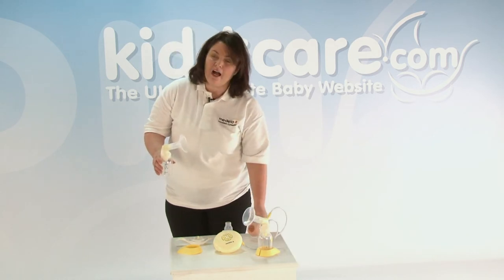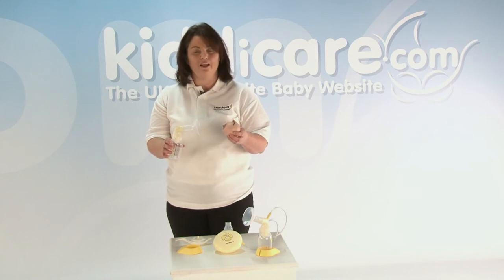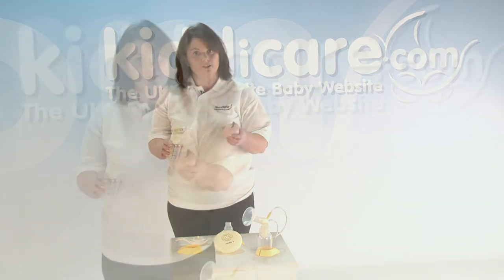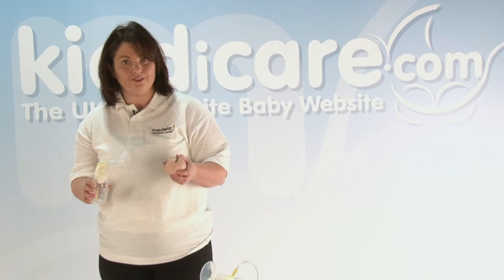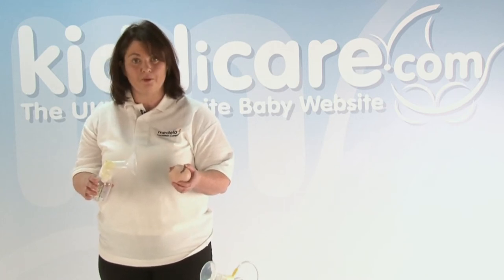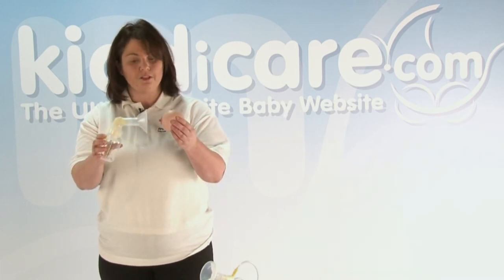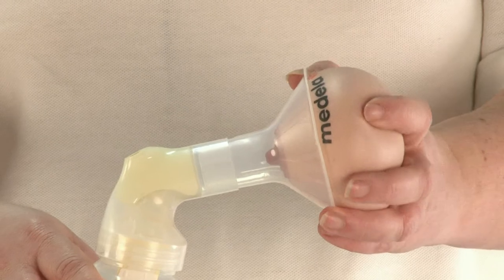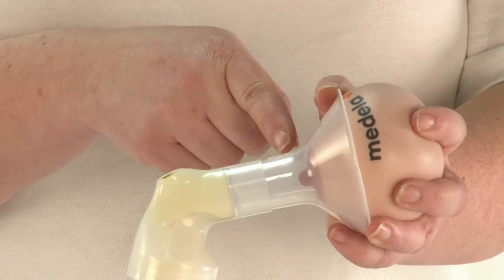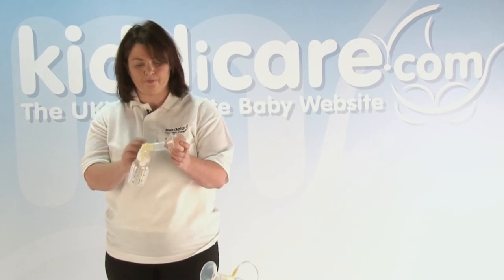When we're talking about how the pump works, it's very different to breastfeeding, how we put the pump onto the breast. When you put the baby onto the breast, do you remember how the midwife used to tell you, nipple to nose, chin to breast? That's not how we do it when we're using a breast pump, because we need to make sure that the nipple is positioned centrally, so making sure that it's not too snug or not too big.